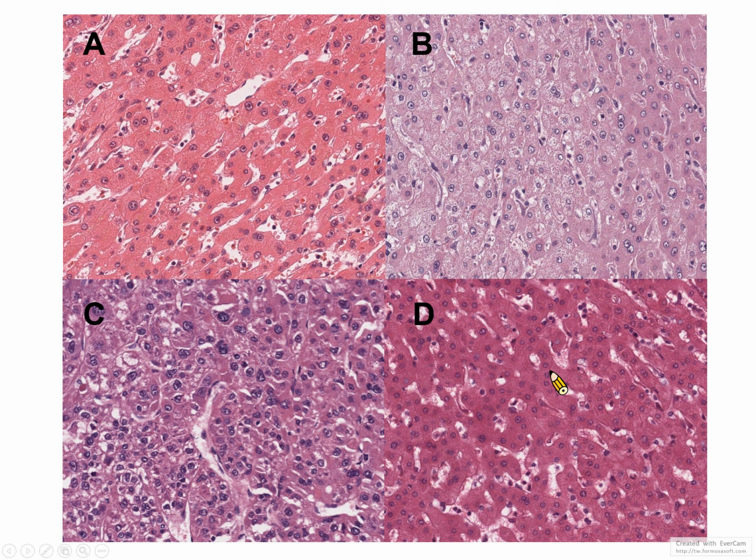For the cancer cells, it usually has a larger nucleus because it has more activity in DNA replication. It is larger, and because it has more DNA replication and more chromosome activity, it will be darker in color. So the first one is bigger size of the cancer nucleus, and the second rule is darker color in the cancer nucleus.